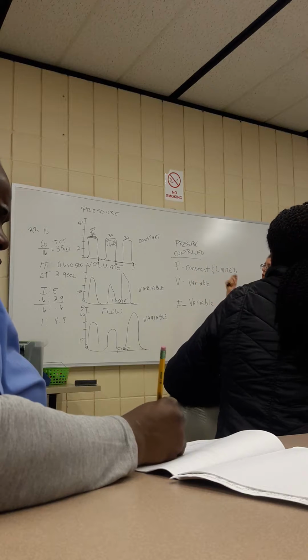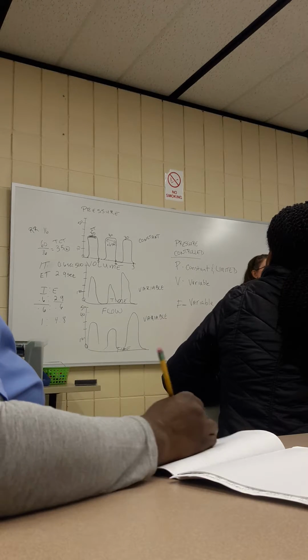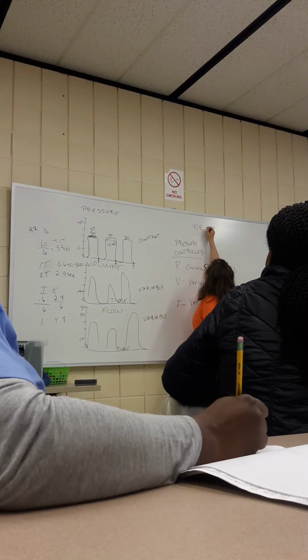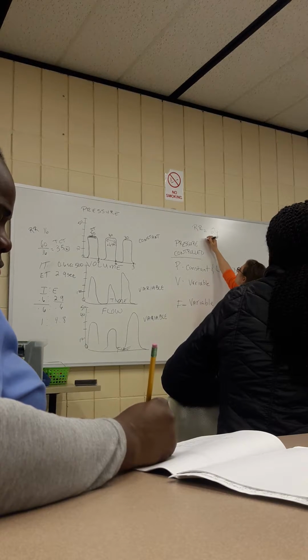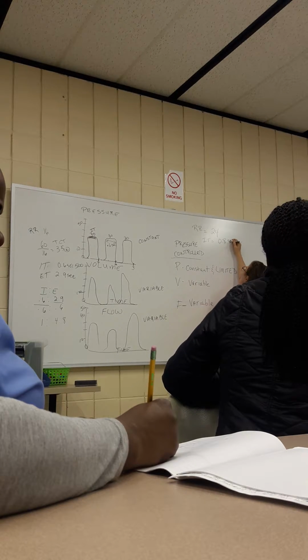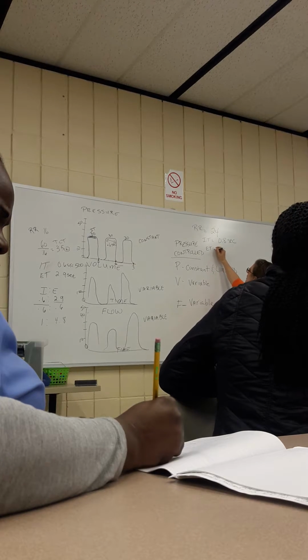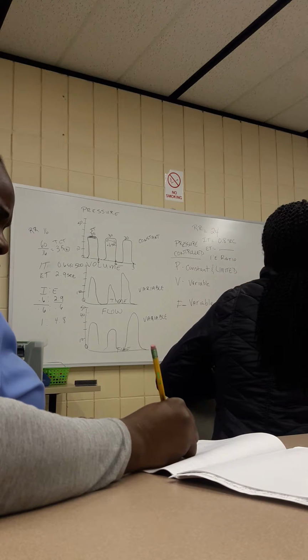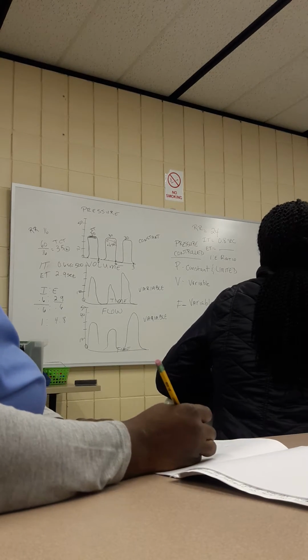If I ask you, this is the total cycle time, and here's your respiratory rate. I give you a respiratory rate of 24, and your inspiratory time equals 0.8 seconds. You should be able to figure out the expiratory time. So 60 divided by 24 gets your total cycle time, then subtract the inspiratory time to get your expiratory time, which then gets you that I:E ratio. Do I expect that you can do that? Yes.